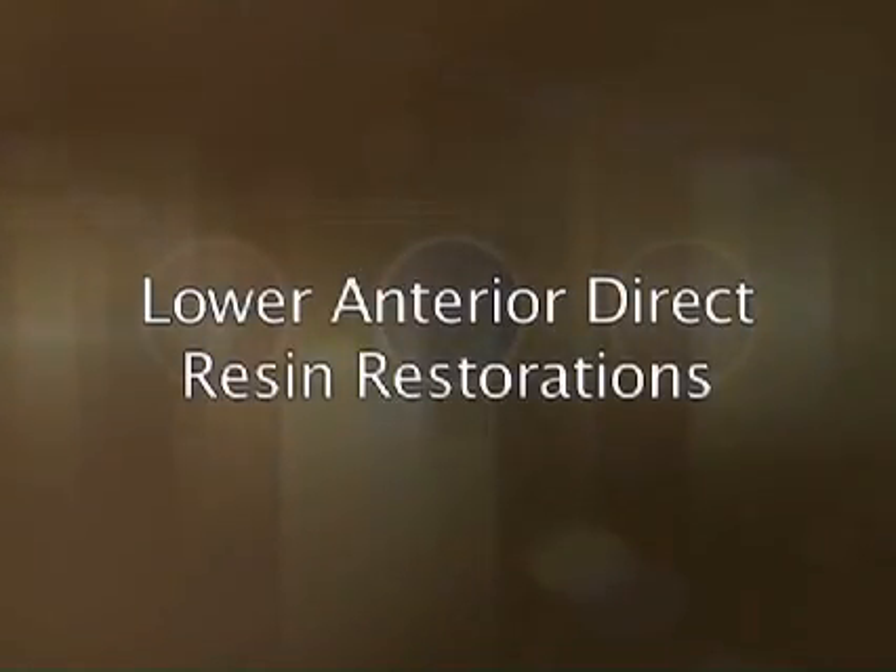In this segment, Dr. Kozarski discusses and demonstrates aesthetic lower anterior direct resin restorations.